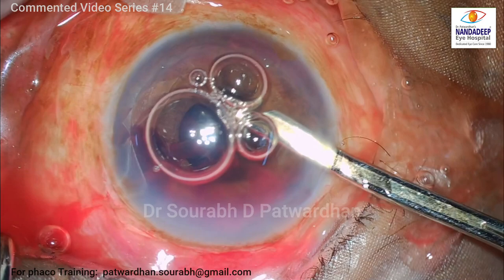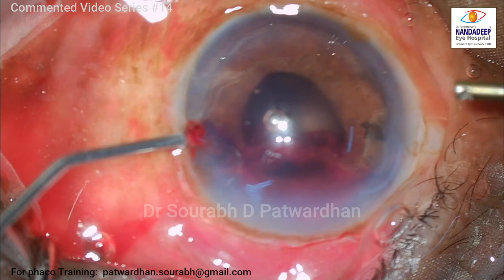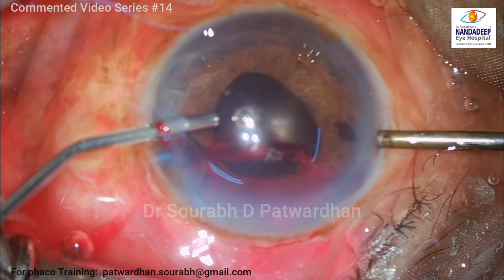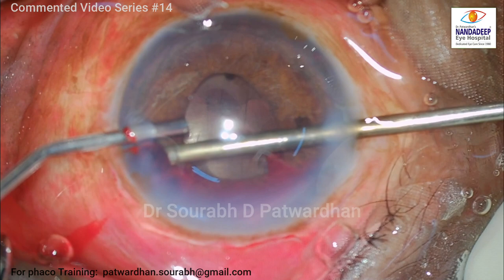I'm just washing it off very carefully and gently — just the liquefied part of the blood. Once that is done, I have to remove the remaining clot using the vitrectomy probe. With the vitrectomy probe, I use a moderate cut rate, around 300 to 500, and I'll be using low vacuum — not very high vacuum — to avoid any injury to the iris.